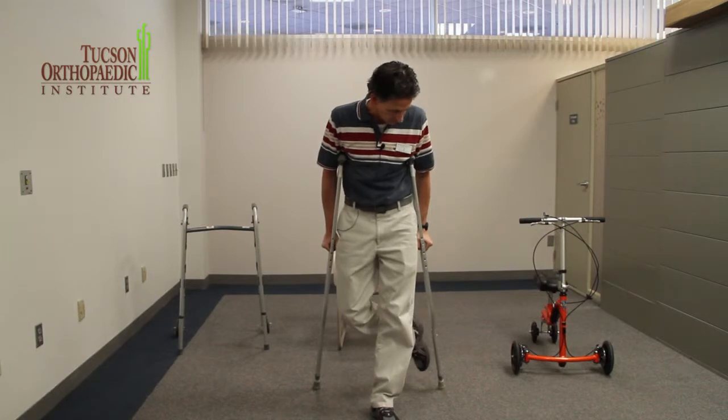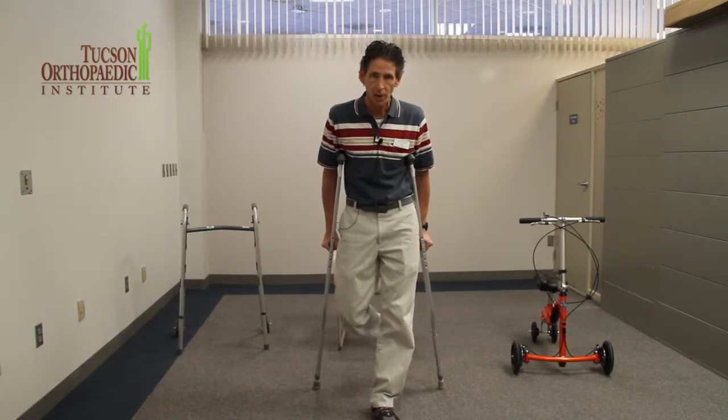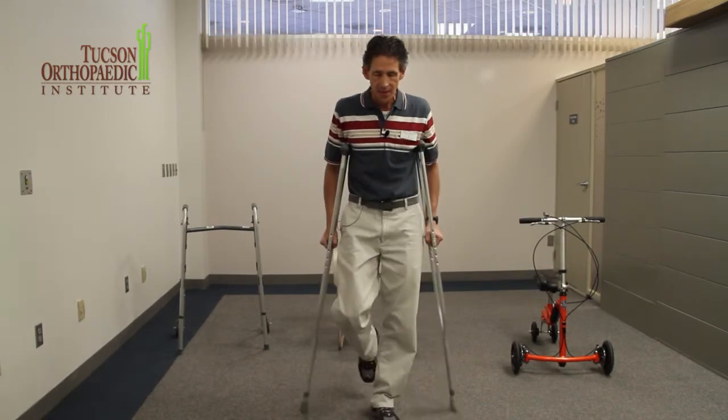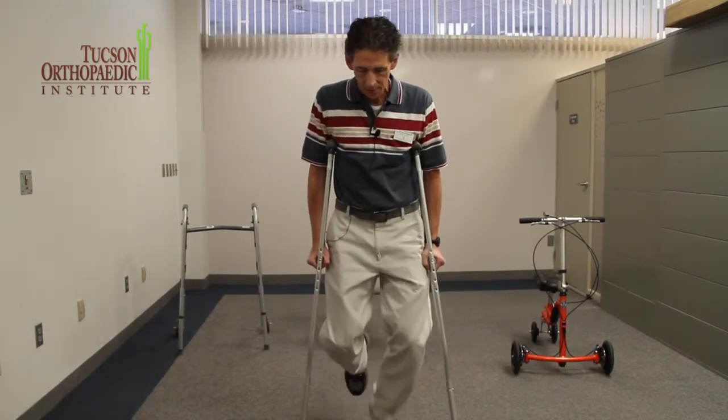What I maintain on the floor is a point of support here and a point of support here with the crutches and my foot, and that becomes a triangular base. And then when I'm going to walk, I'm going to do the same thing and swing through.